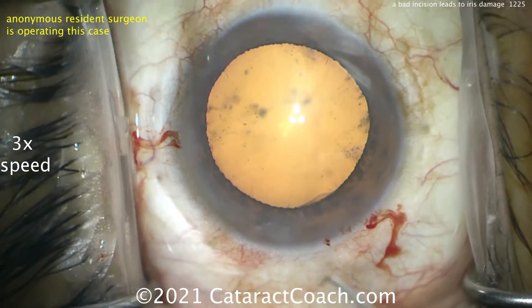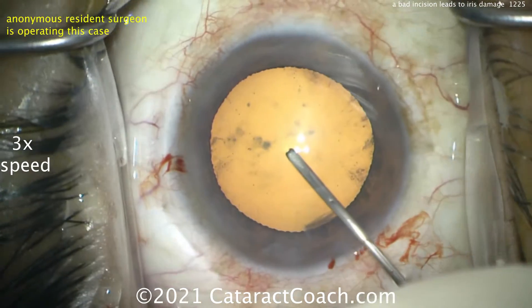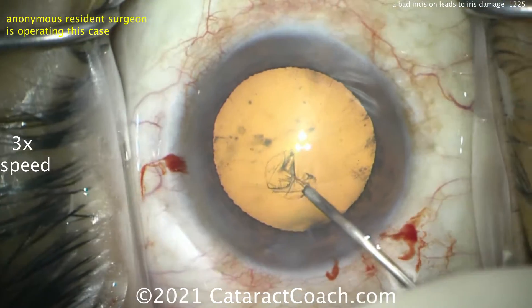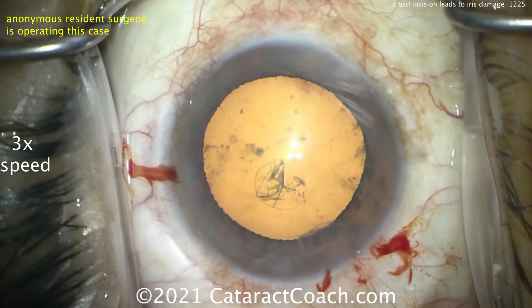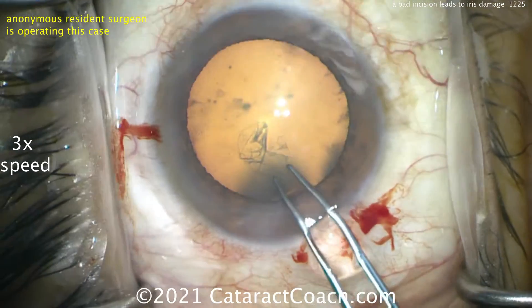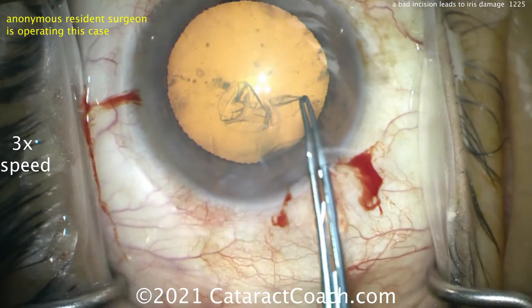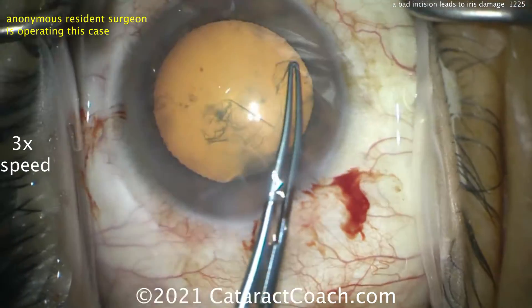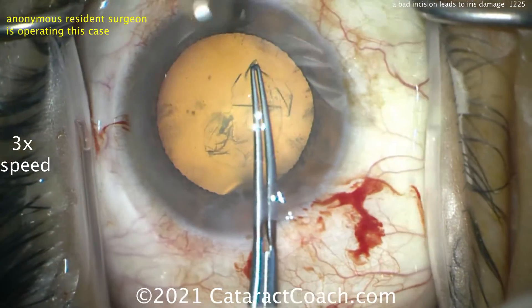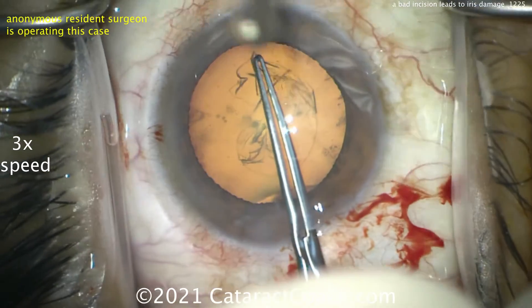Now the incision is too wide. What's the problem with an incision that's too wide? You're going to get anterior chamber instability. Remember, there's one source of fluid going into the eye — that's the balanced salt solution bag or bottle. There are two sources of fluid outflow: one is what you're aspirating through the phaco tip, and the second is what's leaking from your incisions. He's going to have a lot more incision leakage, and that's going to cause instability — the inflow is not going to be able to keep up with the outflow.